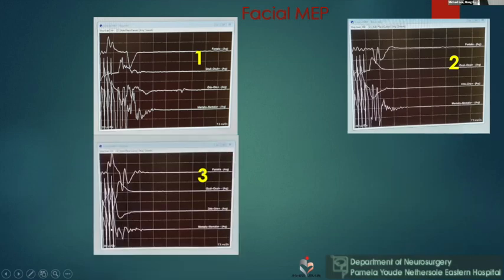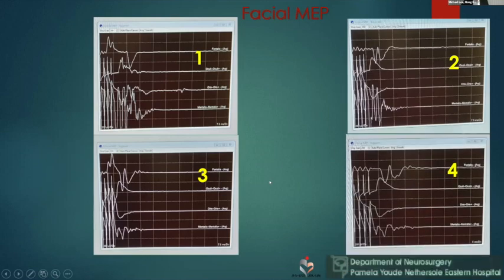So this looks much better. You can see after four stimulations, all the tracings got some response, literally. So we should use the lowest stable response. I'm still not very satisfied with this one, because in some machines you will have this truncated off because of some setting within the machine. You have the stimulation artifact truncated off.